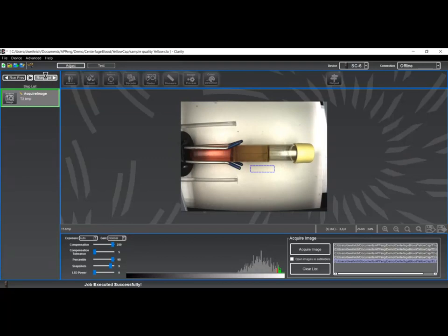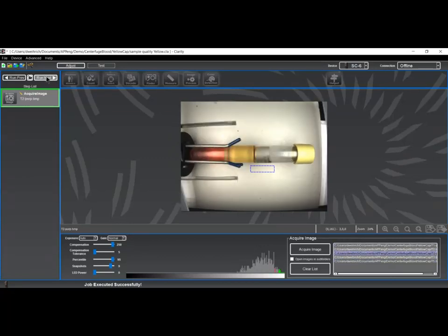For each of these samples, what is of interest and the areas to be measured are the color and purity of the serum section and the color of the red blood cell section. There's also measurement being done on the total volume to guide machinery that's farther down in processing, maybe inserting a needle through the top that will be pulling a sample. It needs to know the height of the serum and of the red blood cell areas because it's going to go into one or the other to pull a sample out of the test tube.